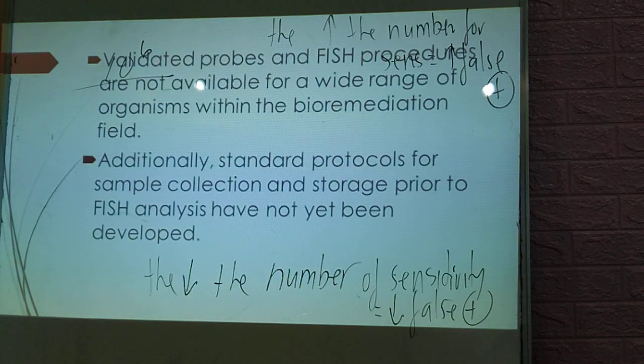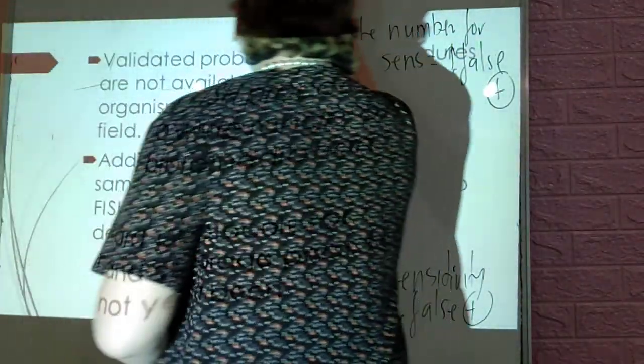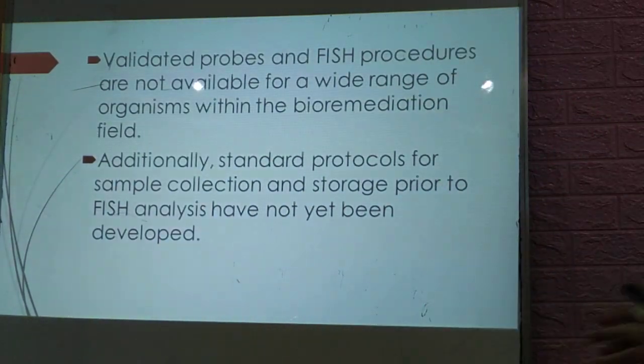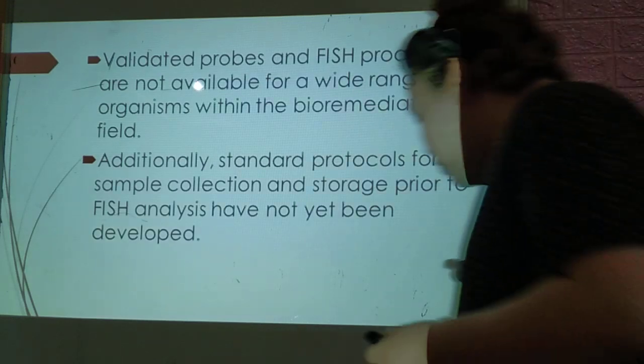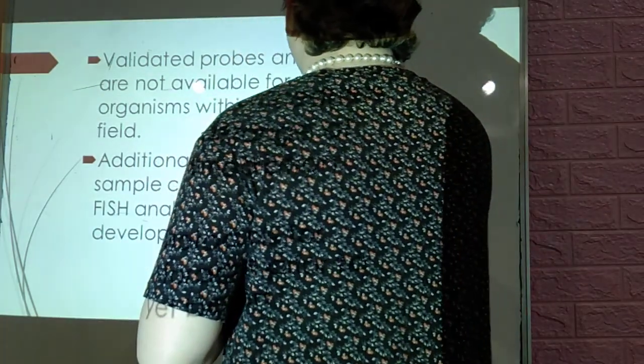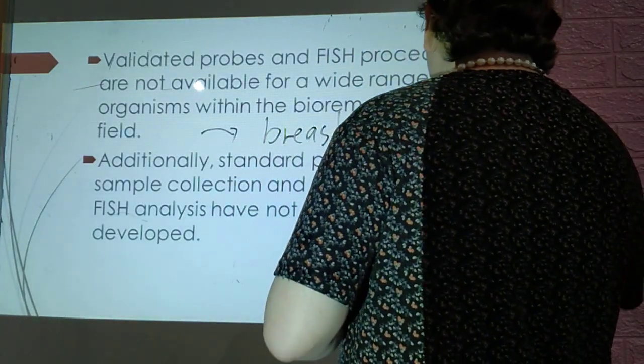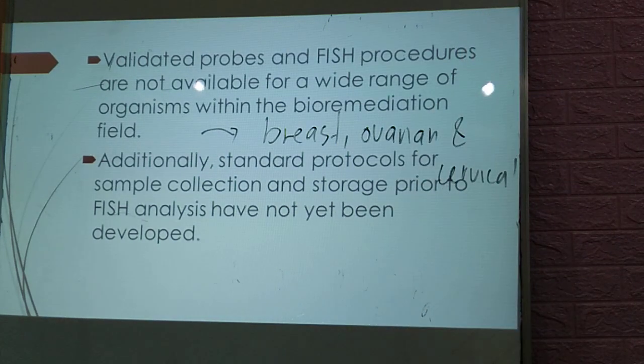Okay, let's continue. Validated probes and FISH procedures are not available for a wide range of organisms within the bioremediation field. But it is now applicable to cancers such as breast cancer, ovarian cancer and cervical cancer. Additionally, standard protocols for sample collection and storage prior to FISH analysis have not yet been developed. But if I'm not mistaken, for microbiology, it is already standardized.